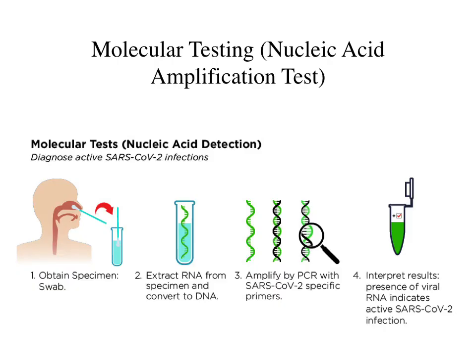Nucleic acid amplification testing requires respiratory samples from the patient because, again, COVID-19 is a respiratory virus. Nasopharyngeal swabs are most commonly used. Lower respiratory secretions, such as sputum, are also used if a patient has pneumonia or lung involvement with infection. Samples are then processed and tested for COVID-19. The test includes extraction of RNA from the patient specimen, conversion to DNA and PCR amplification with COVID-19 specific primers.